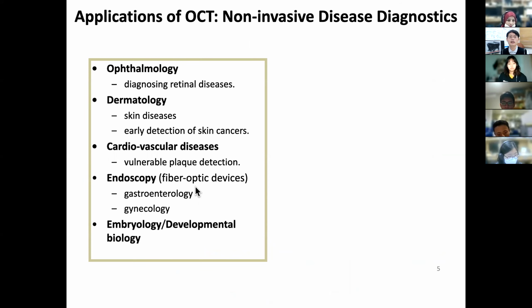So really, this non-invasive disease diagnostics enabled by OCT has been used at virtually anywhere you can imagine. For example, in ophthalmology, the posterior part of the eye, there's the retina. So retinal disease diagnosis is excellent because previously we used a fundus camera, which only sees the top surface, but the disease is not only happening at the top surface. So with OCT, T stands for tomography, which means it sees below the surface layer by layer. This is just a great technique, non-invasive.